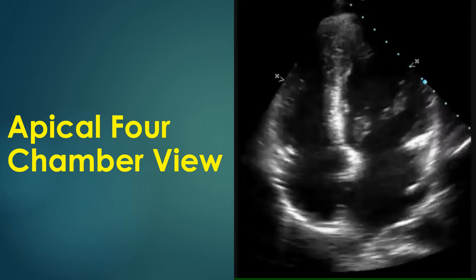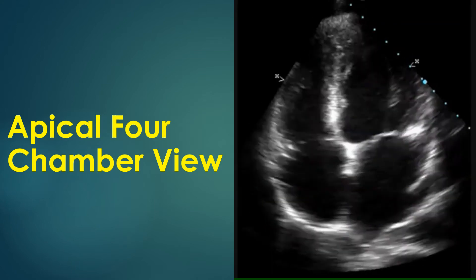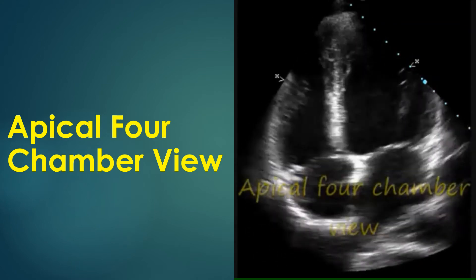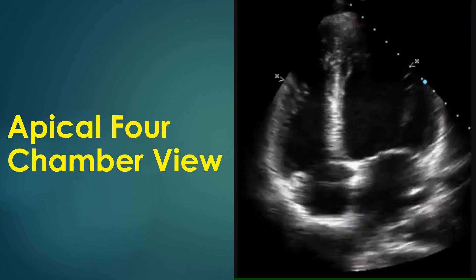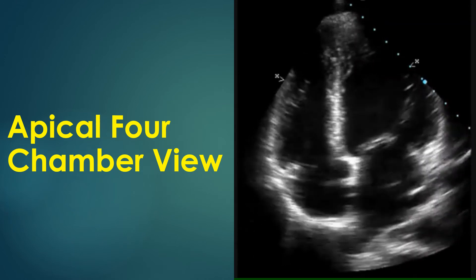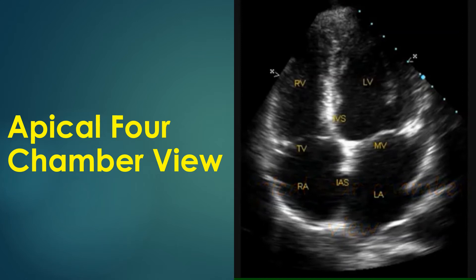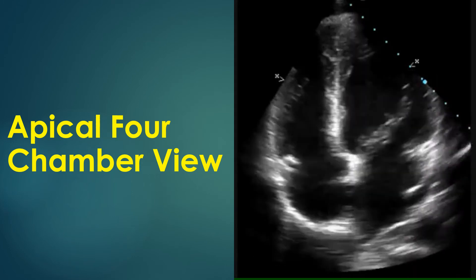The apical four-chamber view is obtained from the apex of the heart. It gives a good image of all four cardiac chambers as well as the mitral and tricuspid valves. The inter-atrial and interventricular septum are seen in this view. The tricuspid valve is attached more distally to the septum than the mitral valve, and the region in between is called the atrioventricular septum, which separates the left ventricle from the right atrium.